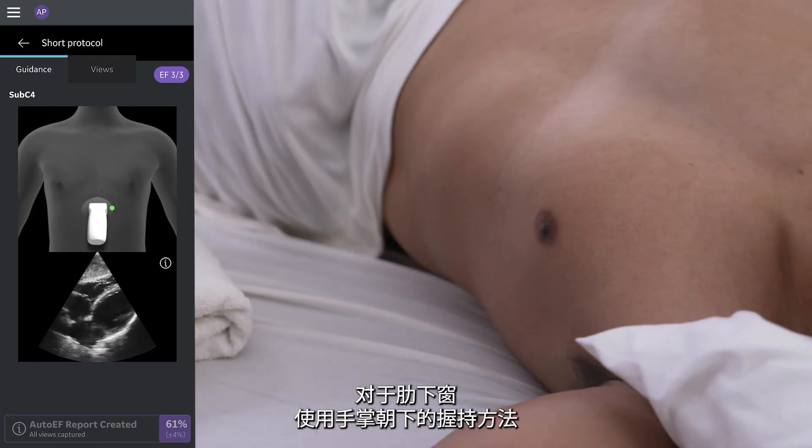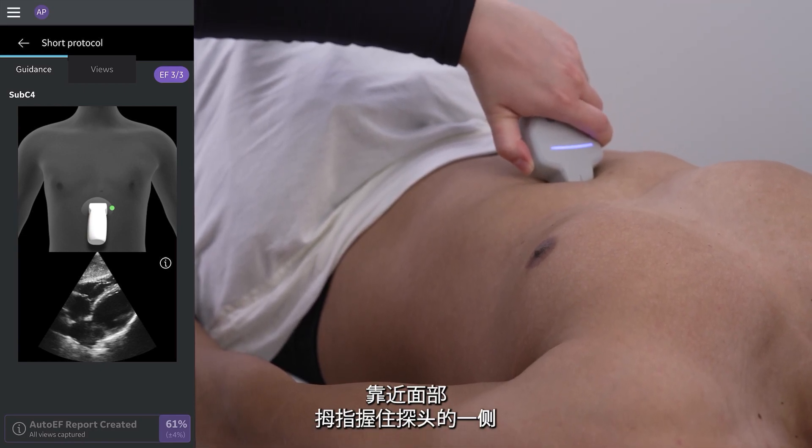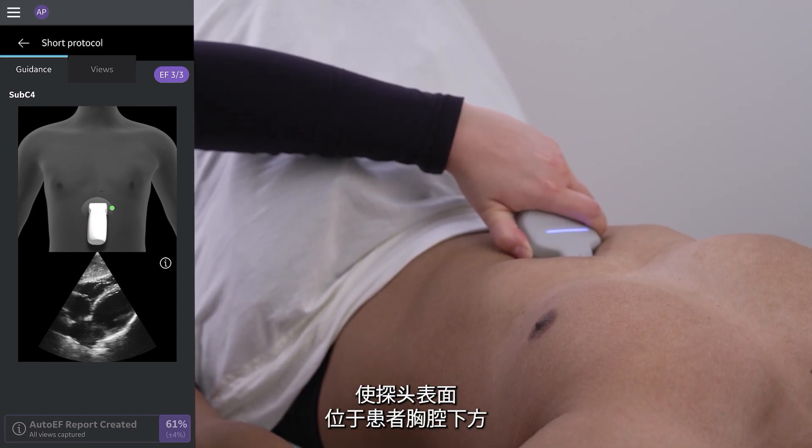For the subcostal window, we use an overhand grip. Grip the probe close to the face with your thumb on one side and the rest of your fingers on the other side. Push down and motion upwards to have the face of the probe under the patient's ribcage.